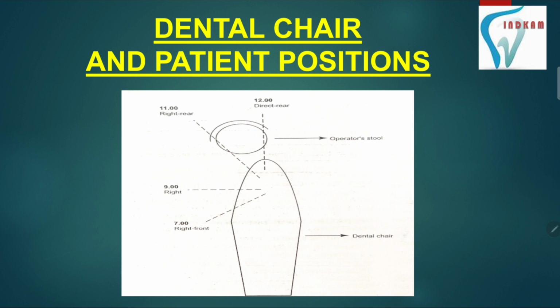Until a few decades ago, most dental procedures were performed with a patient seated upright and a dentist standing next to the patient. However, standing for a prolonged period and bending over the patient results in poor body posture and creates musculoskeletal disorders for the dentist. Hence, to improve the health and endurance of the dentist and the comfort of the patient, most restorative procedures are now performed with the dentist seated and the patient in supine position.